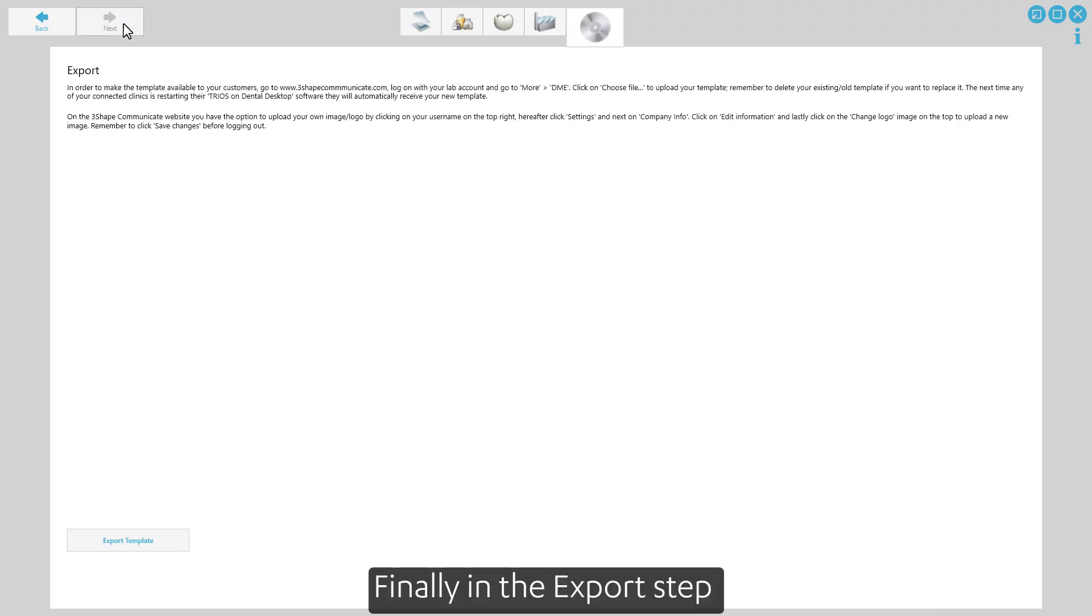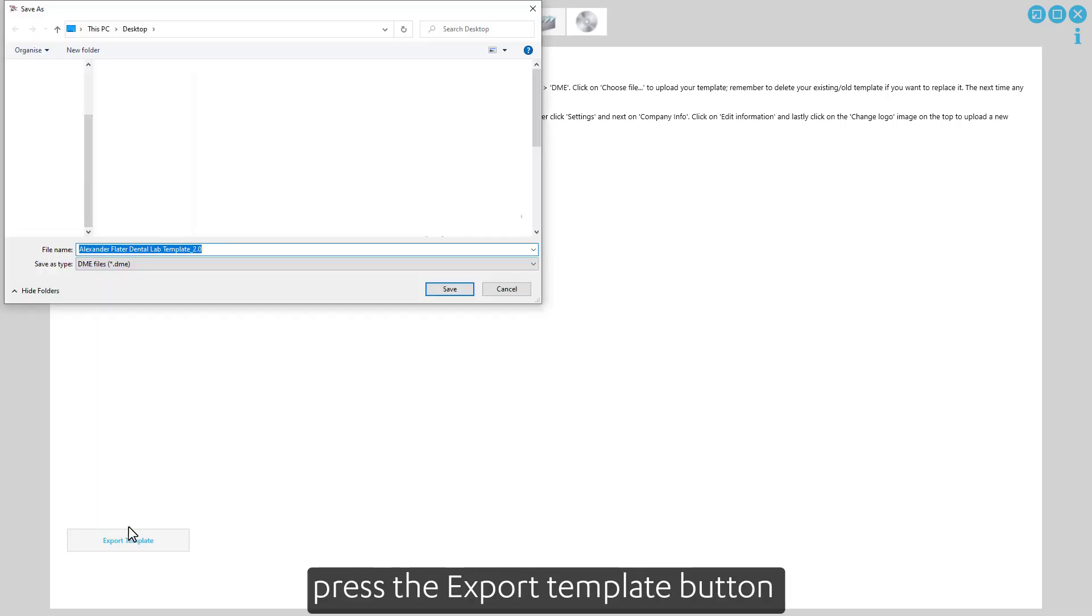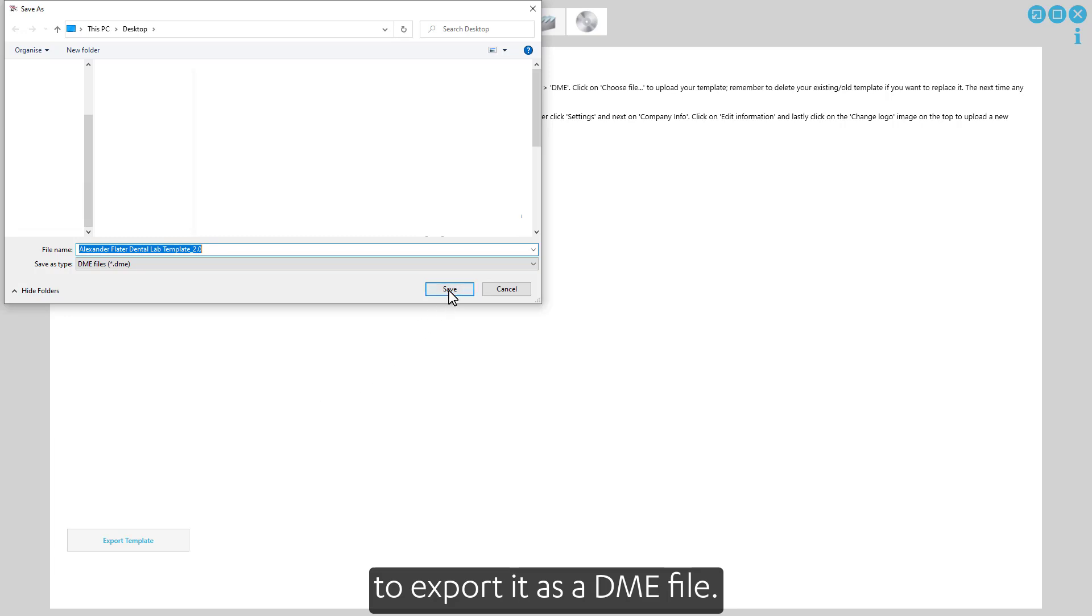Finally, in the export step, when the template is ready, press the Export Template button to export it as a DME file.